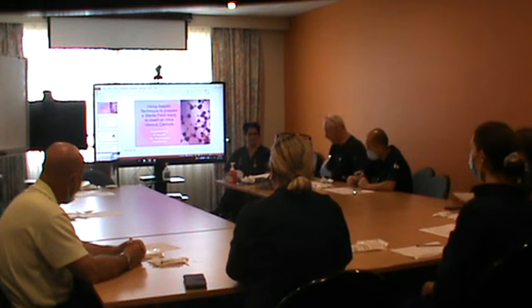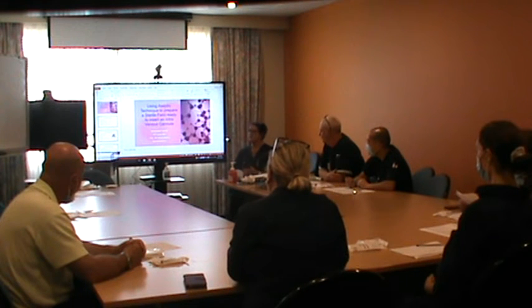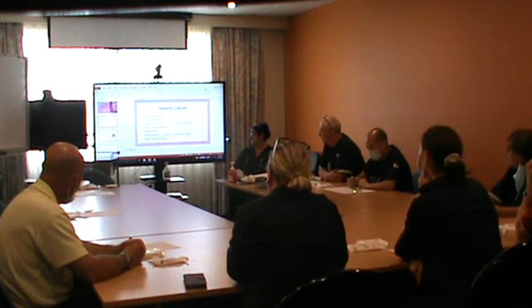So this is the second presentation that follows on from the first one that I did on aseptic technique. This is actually using aseptic technique to prepare a sterile field ready to insert intravenous cannulas. We all know that cannulas go into veins, and we want to keep it nice and clean. Last time we did the whole process of setting up an aseptic technique because there is a bit of a trick to it, and some people hadn't really done it before.